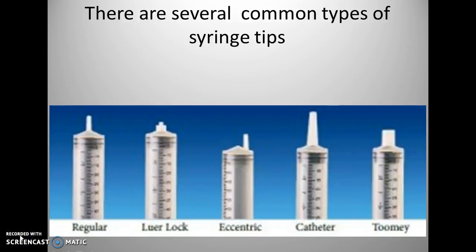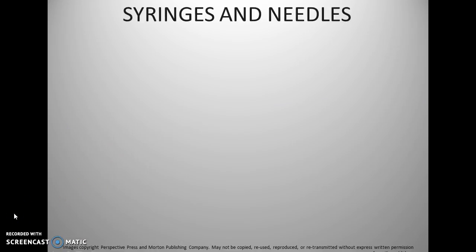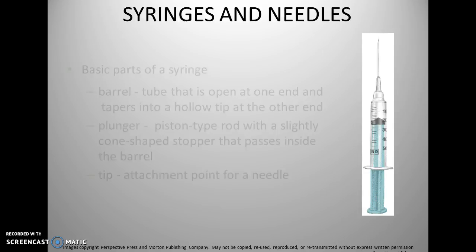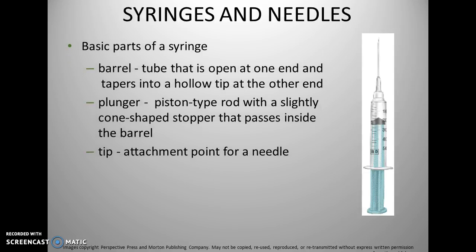Okay, we have completed looking at syringes, and we're going to move on to our next topic here, and that is dealing with, well, a little bit more than syringes and needles. Okay, so the basic part of the syringe is the following.